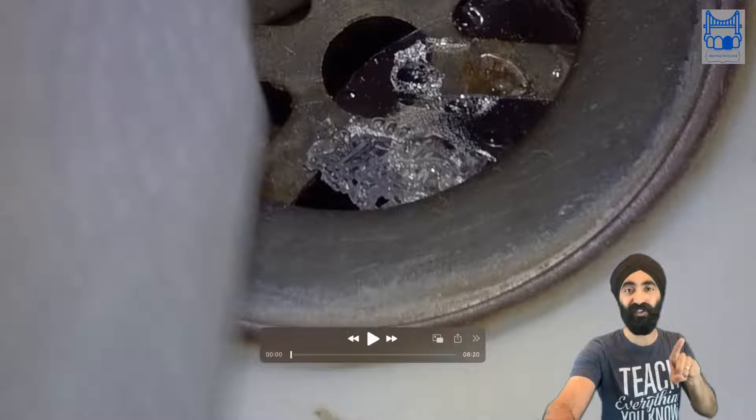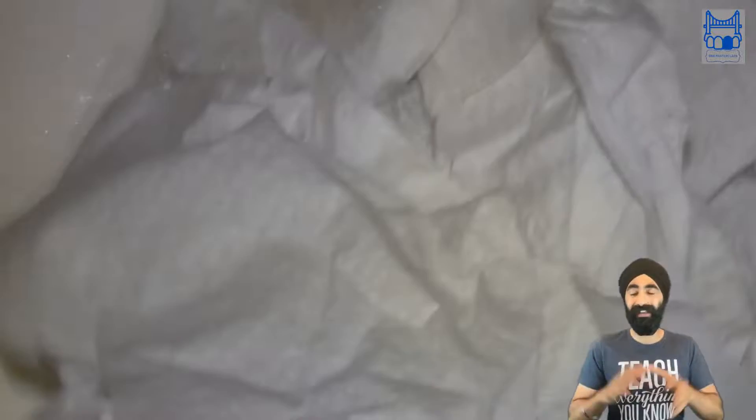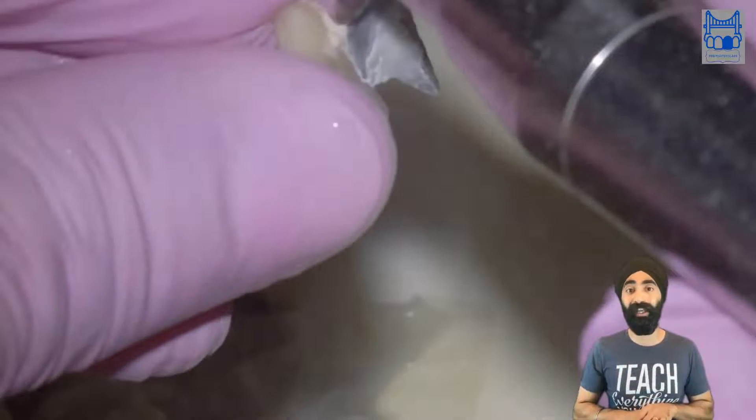The very first thing to do with any indirect restoration that you clean in the sink, like I did here, is you block the sink with tissue paper. It's never happened to me where a veneer or something has gone down the sink, but it could happen. It's a very easy thing to do, so block it.